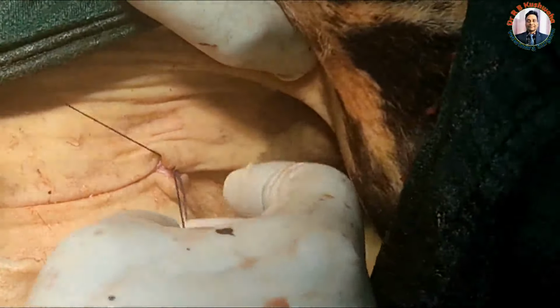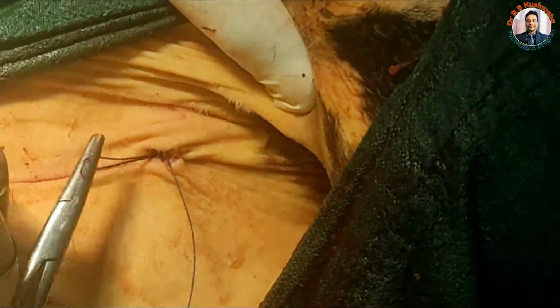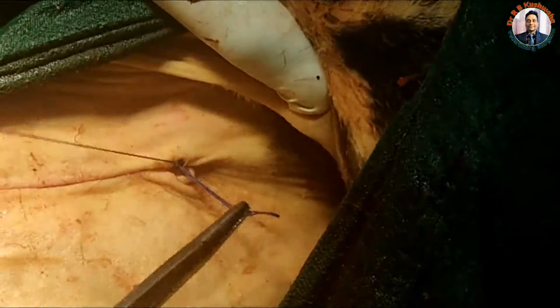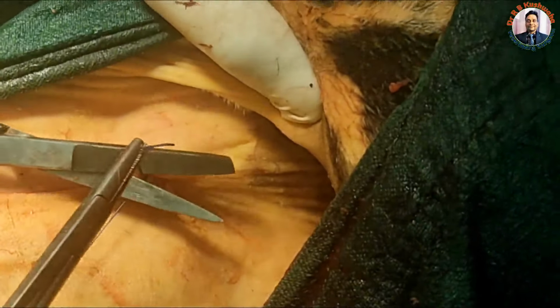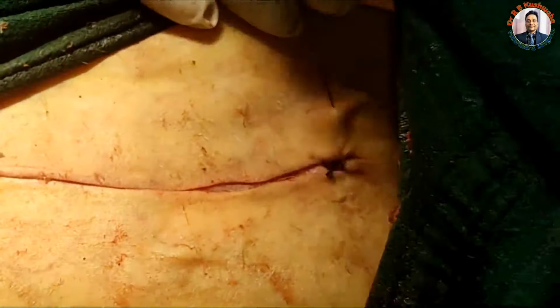This is the closest, so it's better to apply here than not. So this is the buried suture, so pull like this. Now cut it from here.